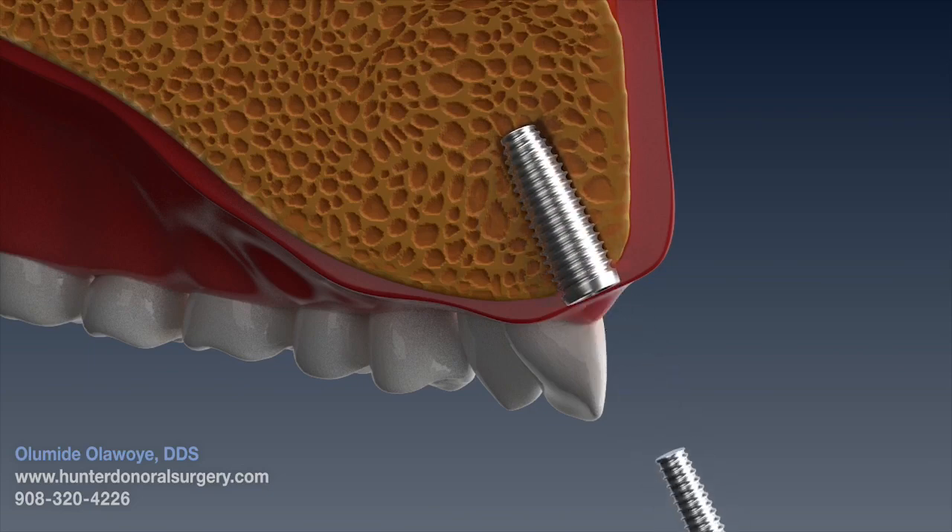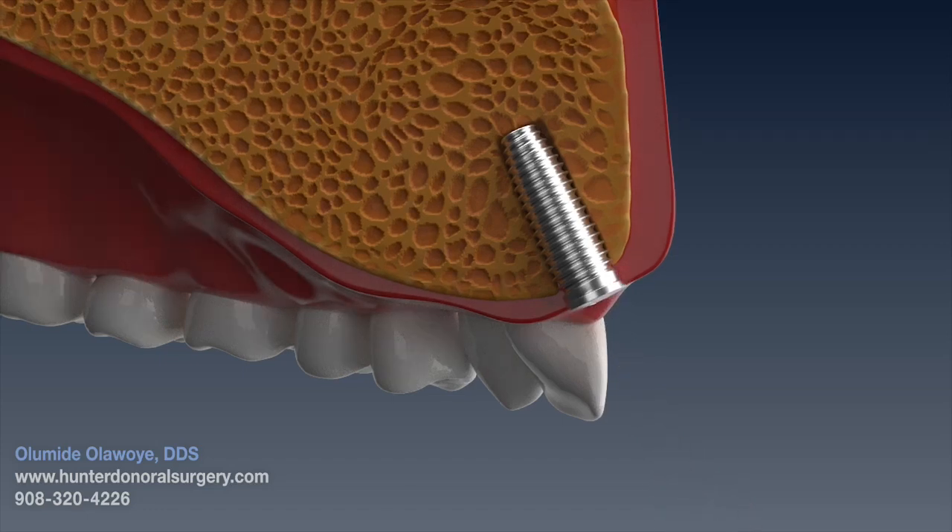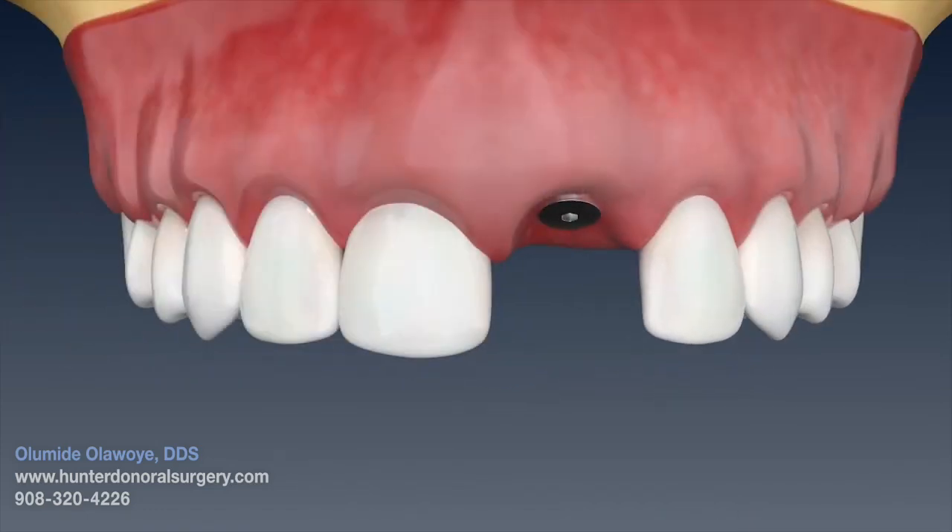Sometimes, in aesthetic areas, a temporary crown may be placed right after the implant is placed.